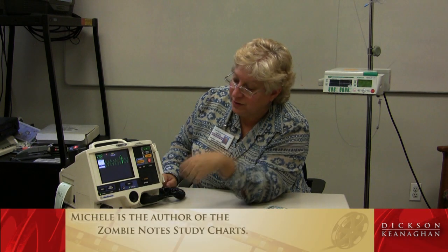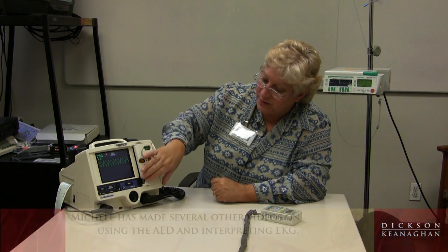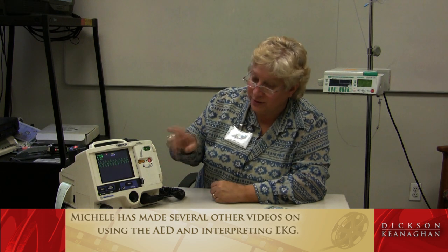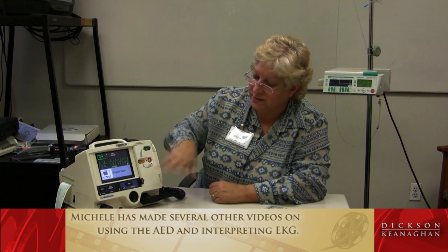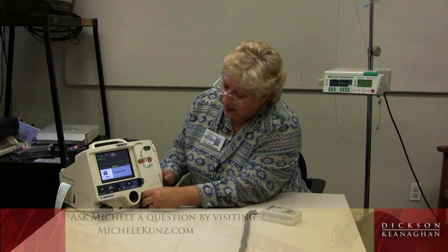It also gives you other leads: lead one, two, three, and of course the paddles if you have pads or paddles on. Pressing the print button again should stop the printing. With the door closed, it's an automatic AED — you put the pads on, press analyze, and deliver a shock, and the machine gives you many directions to do that, including alerts when pads are not connected or not on. To disconnect the paddles, you turn the switch in the back and pull, then connect the pads connector. There's an arrow that always faces upward, and you push the device in. That's a basic overview of your LifePak 20 AED defibrillator.